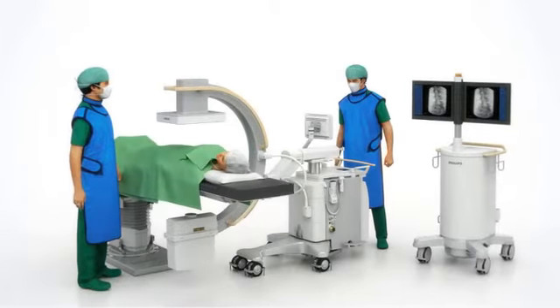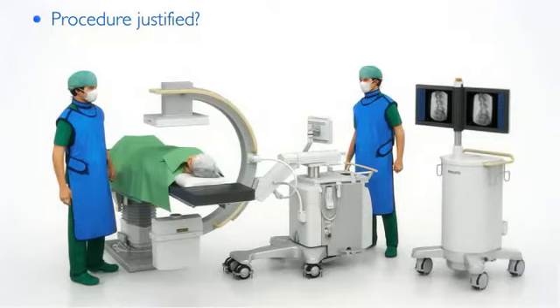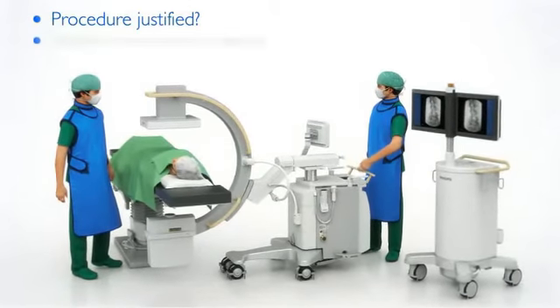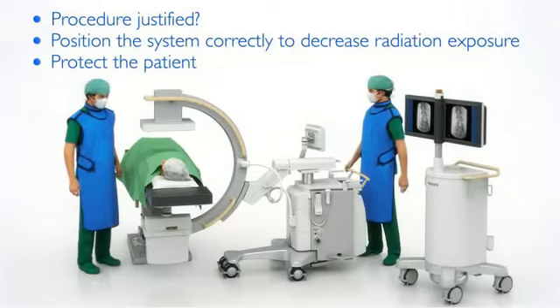Before undertaking any examinations with the C-arm, it should be determined if the procedure justifies its use. Furthermore, a check needs to be done on how the unit can best be positioned to decrease radiation exposure. Furthermore, patient protection should be used where possible.